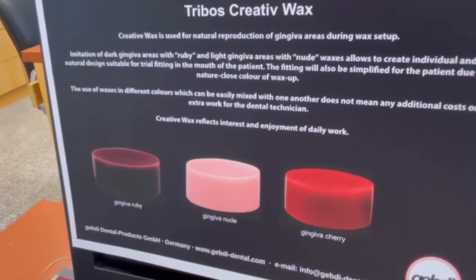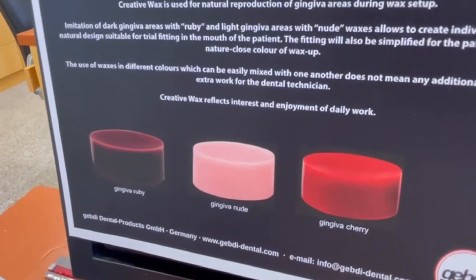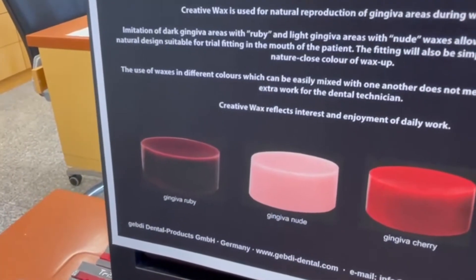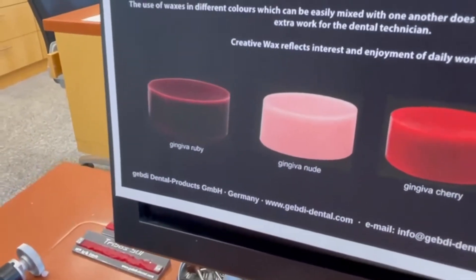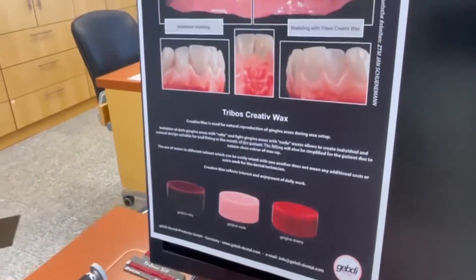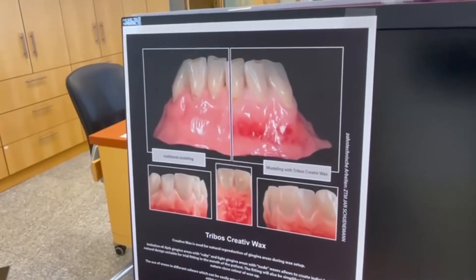We go over the different colors once again. There is gingiva cherry, as you can see, then nude, and also the last one is gingiva ruby — ruby is like in German 'Kirsche'. So Andrea has now finished his work.